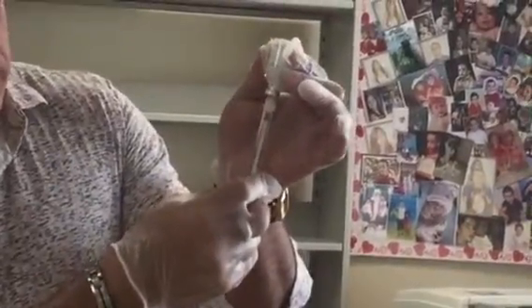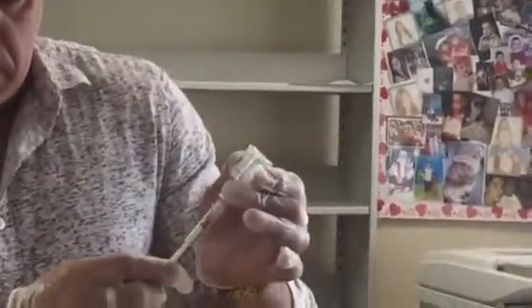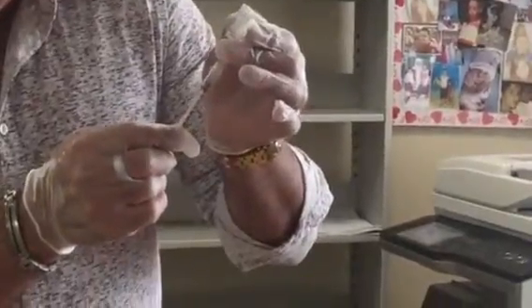Pull back the plunger and get the right dose of insulin. Be sure that there are no bubbles inside the syringe. Take the syringe out and put the syringe down carefully.